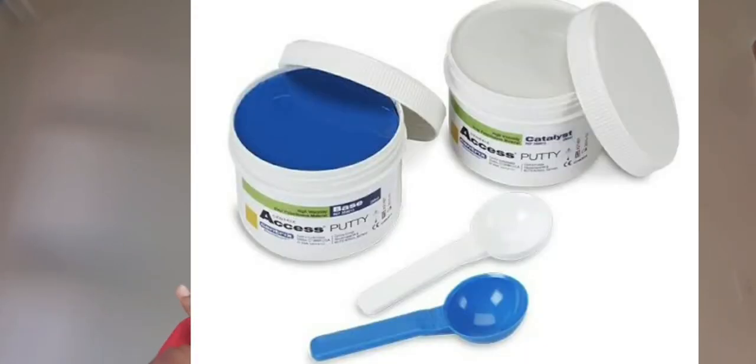Next on the list, we have our silicones. Our silicones, just like the other elastomeric materials, come in tubes of a base as well as a catalyst. The silicones, however, have a lot of different forms, the main one being your putties. So your putty will have 1 tab of catalyst, 1 tab of base. And then the nice thing about silicones is that they act just like your polysulfides, but without all the disadvantages. You remember we talked about the taste, the bad odor, the staining on the patient's clothing and stuff. That does not happen with silicones.